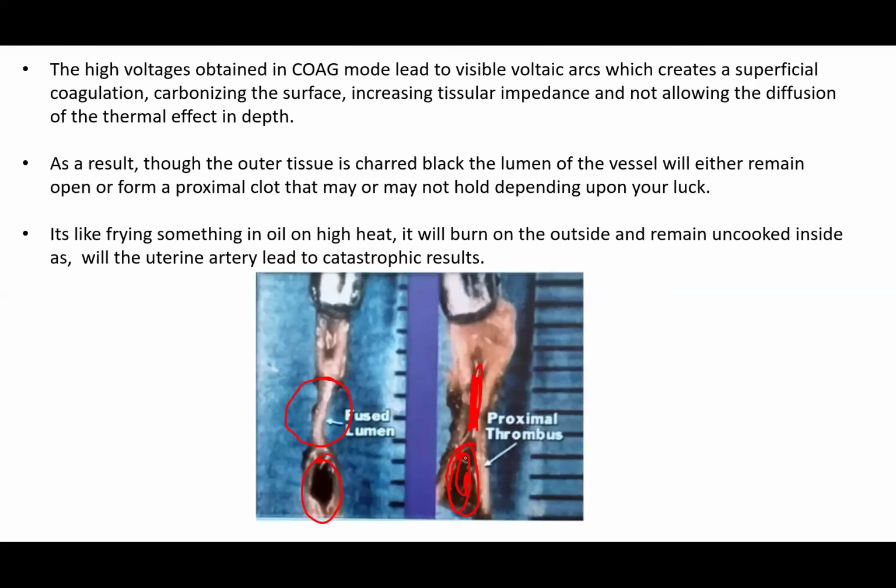So that is the principle you use in securing hemostasis. Now look at this we just mentioned. It can lead to a catastrophic result. So you use a low energy and hold for some time.